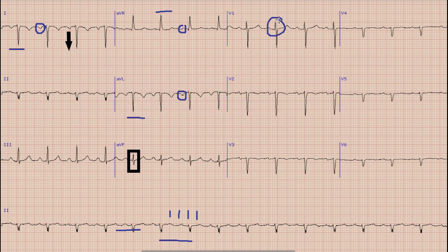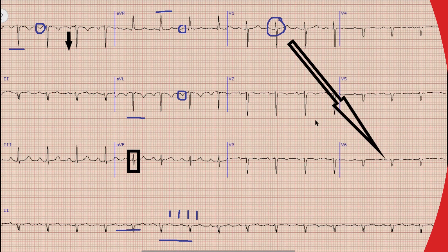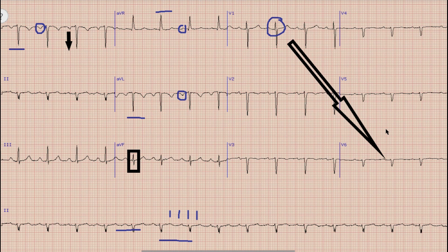To differentiate, we will look at the chest leads. If you look at the chest leads, there is a prominent R wave in lead V1. In a normal ECG, the R wave in V1 is small or minimal, and the R wave increases in amplitude progressively from V2 to V6.